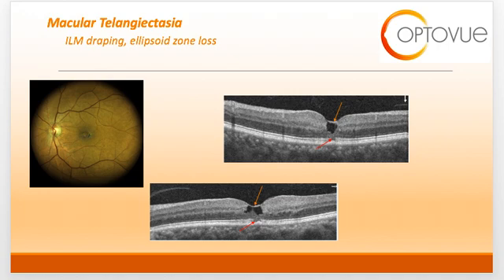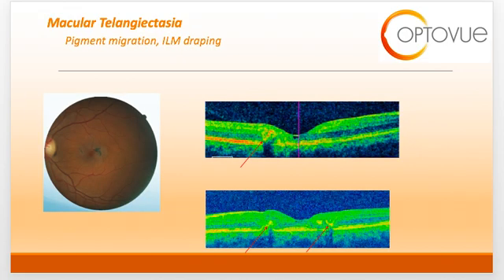The orange arrows on this slide are directed at the areas of ILM draping. You can also see loss of the ellipsoid zone as indicated by the red arrows on this slide. As the disease progresses, the outer retina becomes involved. This slide shows RPE hyperplasia that occurs as a result of continued damage to the outer retina and photoreceptor layer. Hyperreflective areas on OCT correlate to RPE hyperplasia or pigment migration. This can be seen by the red arrows on this scan.